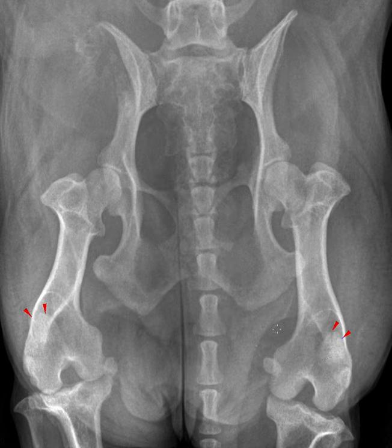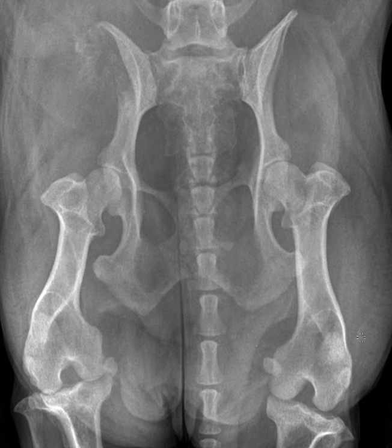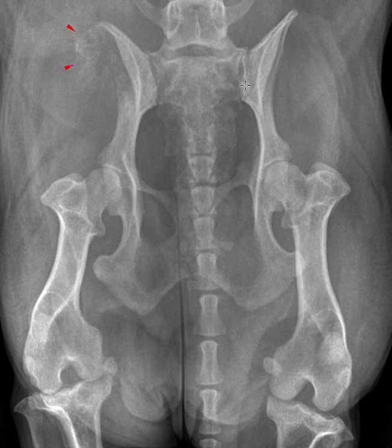Now let me talk about the main findings for this case. As you sorted through the ABCDs — alignment, bone, cartilage, devices, and soft tissue — and you compared the right to left side, many of you will have noticed that there is a difference in the appearance of the right ilium when compared to the left.